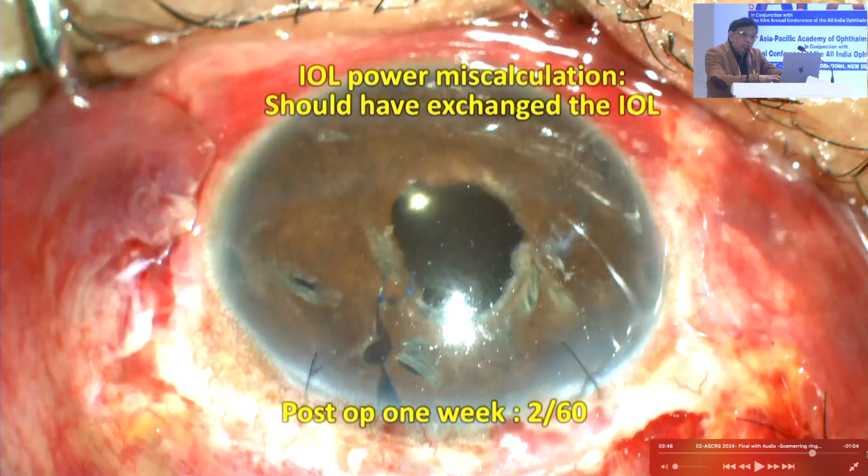I had to change the IOL also. If you see in the beginning, the IOL power was wrong that the surgeon had put. I just missed that, and I had to explant that IOL and put a new IOL. I use the same IOL. Now I had to sit for 1 hour explaining to the patient my mistake. And he said, why you made this mistake? I've come to you. Why you making these mistakes? So now what am I to tell him? I have to keep quiet only, Baba.